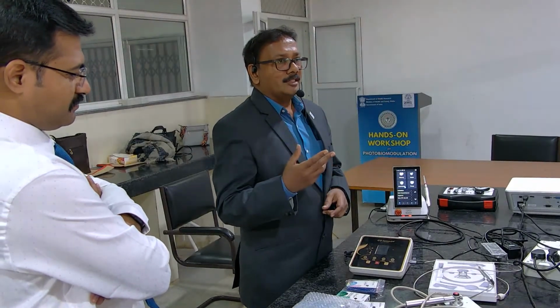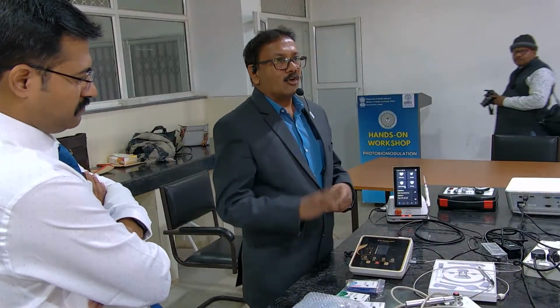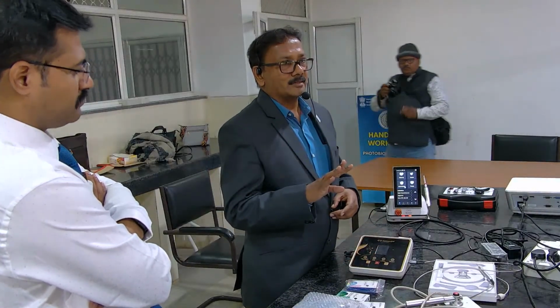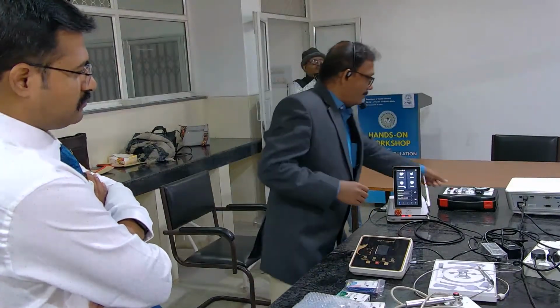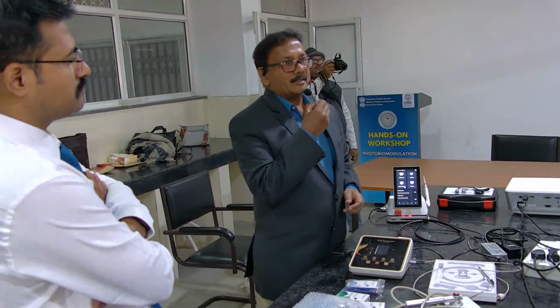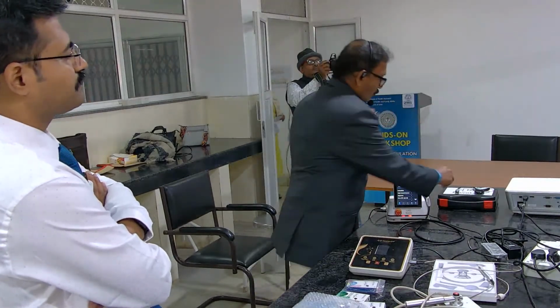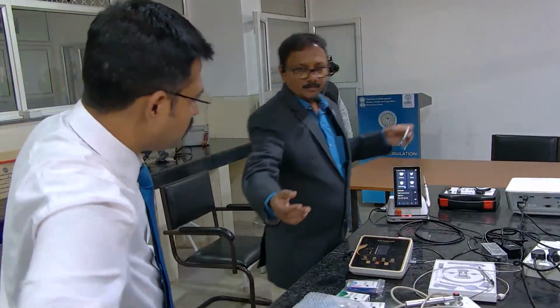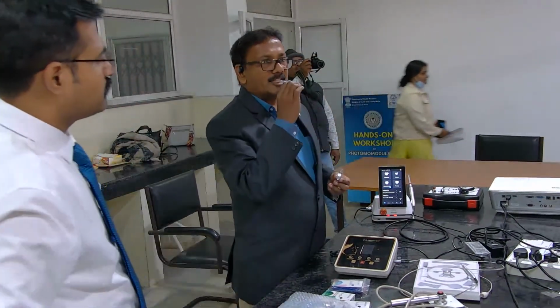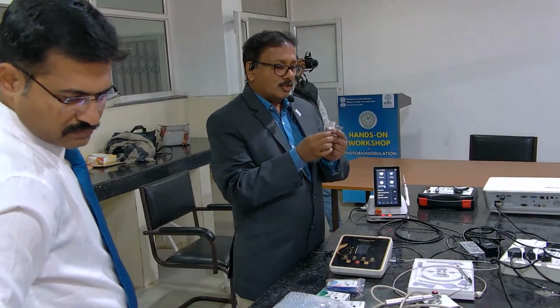No, in 810 nanometers wavelength, all you need is maximum 4 watts, for teeth whitening also. If you're using the 8 tip, it's always 1 watt per tooth. If you're using this prism, Amit, that prism for bleaching of the teeth, teeth whitening procedures, you have to multiply it by 4.